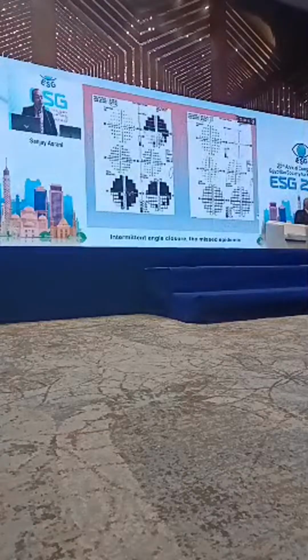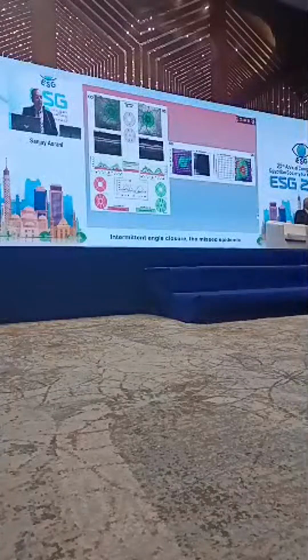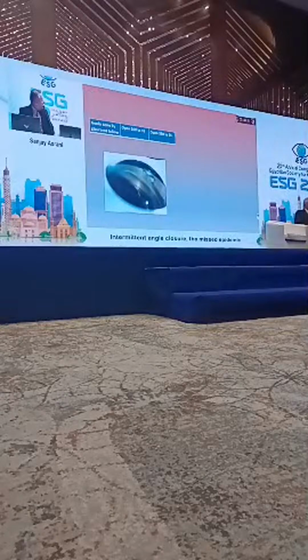If you look at the visual field, you can see the distinct difference between the two eyes. On the OCT, you can see that the nerve fiber layer thickness in the right eye is completely extinguished, and also the macular thickness.